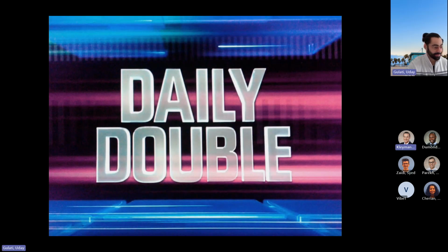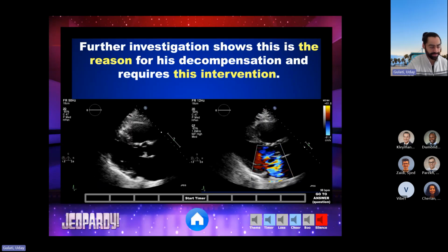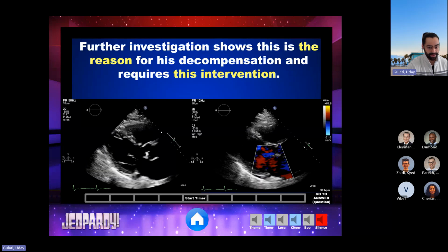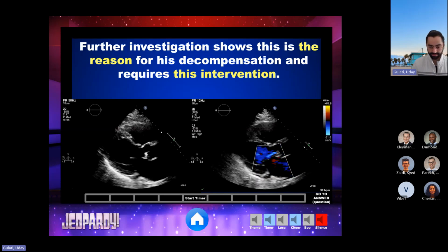So, right, a patient out of nowhere developed a left pleural effusion. They just had PCI done 2 days ago. So you investigate further to figure out why they would possibly have this pleural effusion, and you see this echo. What is the problem, and what do you need to get done? What do you need to do to manage this patient?